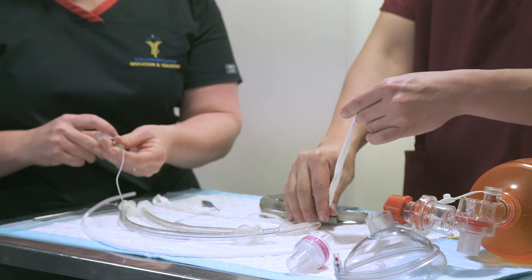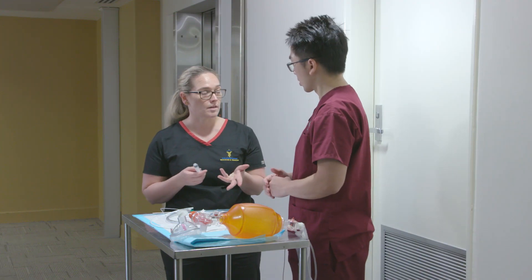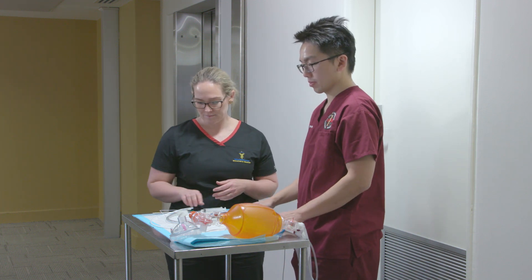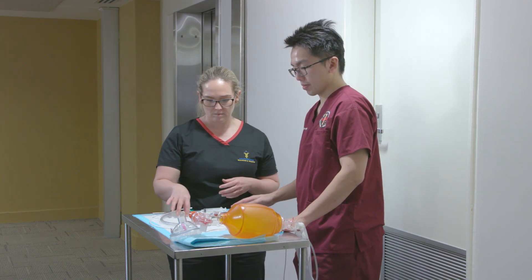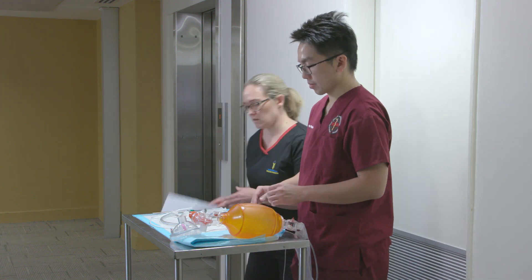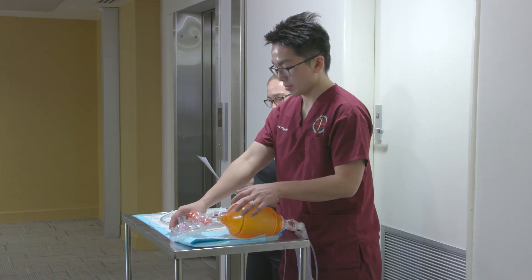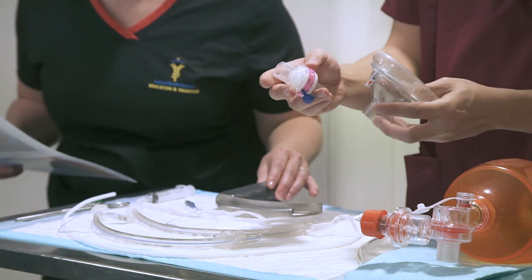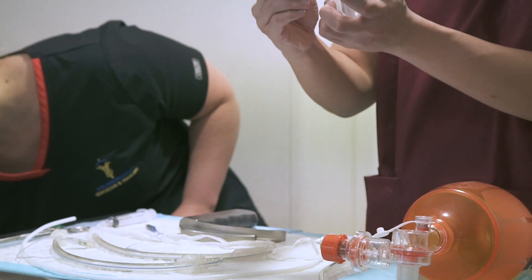Verbalise the airway plan. Prepare the airway trolley outside the room to avoid contamination. Use a checklist if available. Special attention should be paid on how to set up the BVM. A viral filter should be attached to the mask.